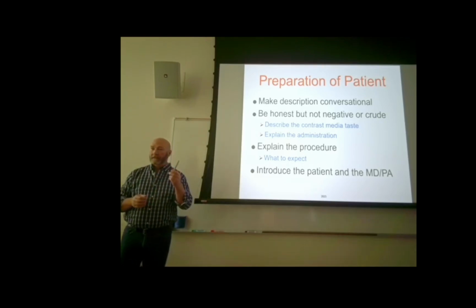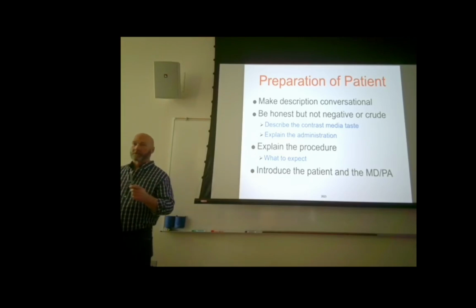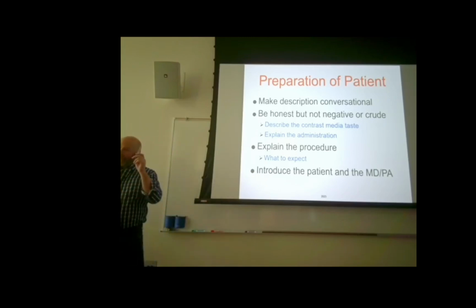They're big, okay? And for whatever reason, every hospital I've ever worked in takes those things, they just throw them away. And then they give them those flexible bendy straws, which are great if the patient's laying on their stomach and sipping the barium while the patient's in the room. Get some of those and stick them in your locker.